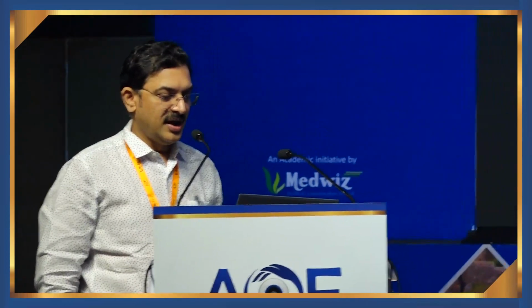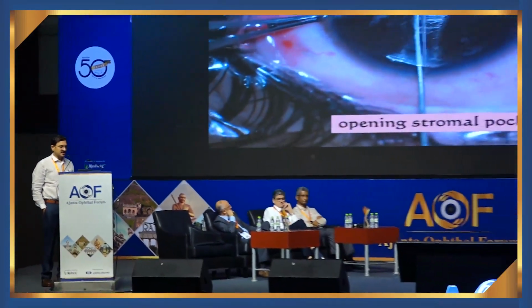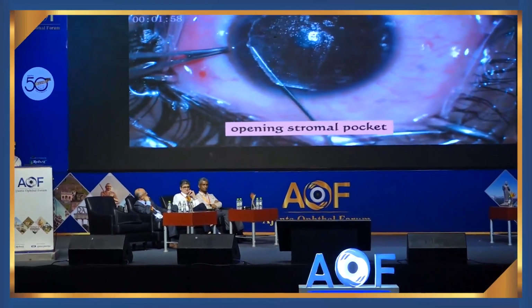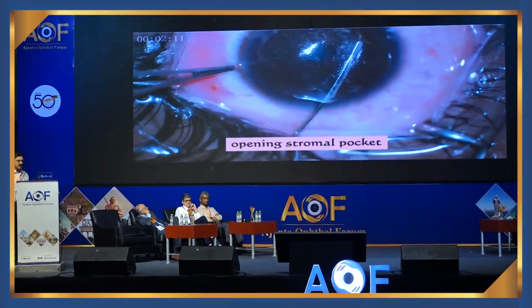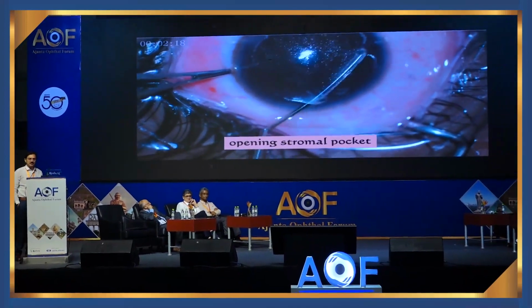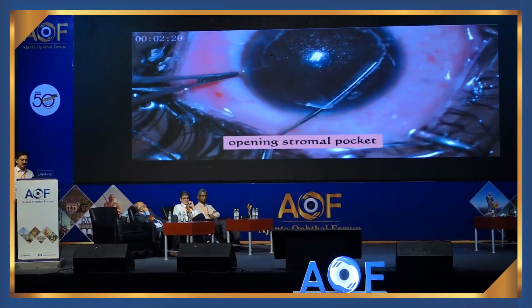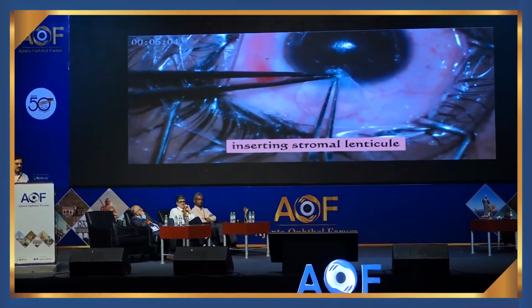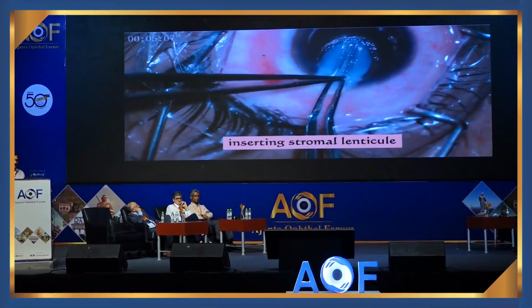Generally, we cut with the femto, as shown by Dr. Namrata Sharma, professor, and we open up the pocket through the hinge. Generally, I put a temporal hinge, and the hinge is cut. The only thing is we switch off the side cut in the femto, or when the side cut is starting, we lift the foot switch.